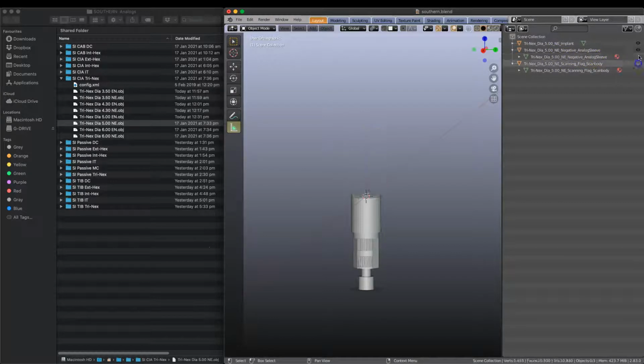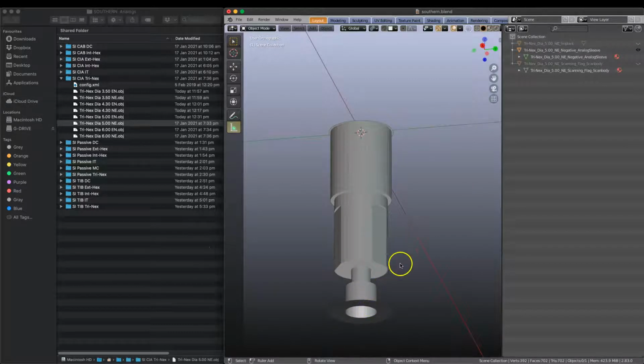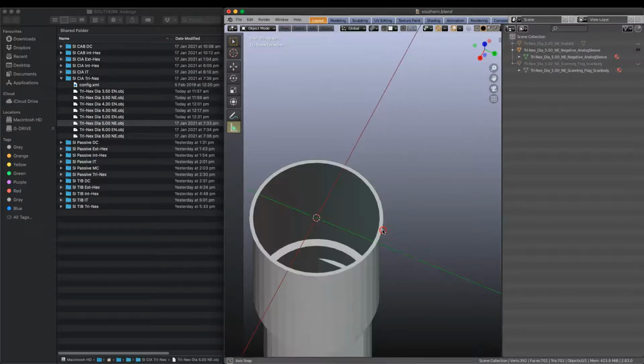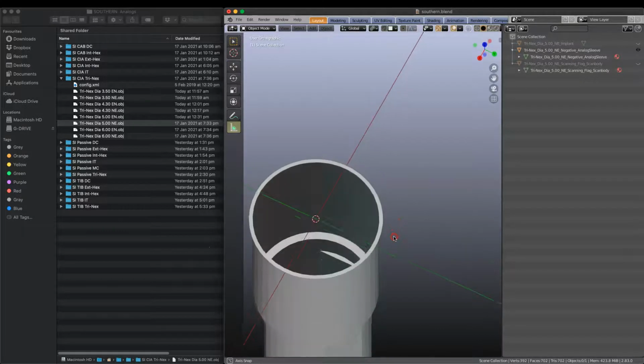So I'm going to be hiding all of those except for the analog sleeve, which is a negative. We've chosen to call the analog sleeve, well, because it's kind of a sleeve into which the analog fits into. If we have a look at this part, we can see that the bottom end caters for a screw, and this screw will tighten the analog from underneath the dental model. So already they have incorporated a ledge on the edge of this part.